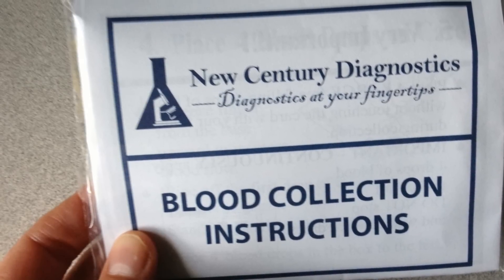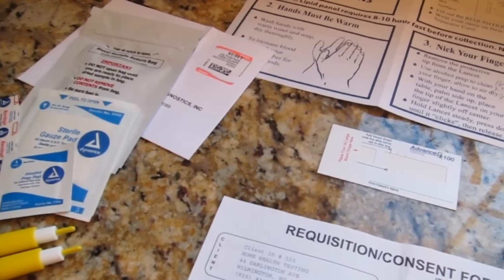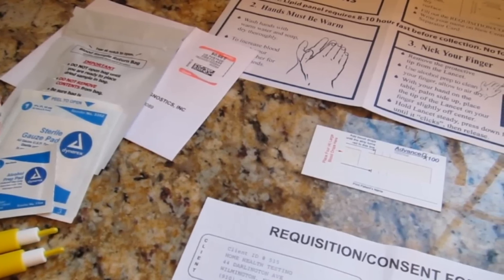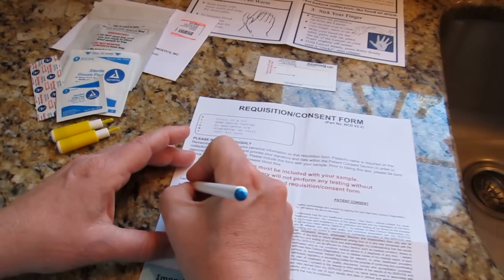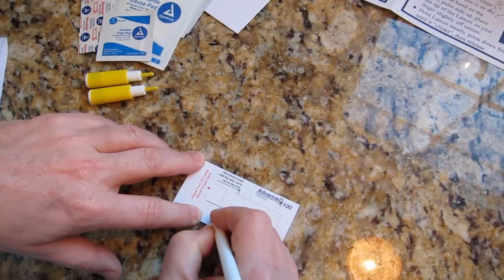In this video we're going to prepare a blood sample to send to the lab for testing. First, open your kit and place it on a clean dry surface. Fill out the requisition and consent form completely and write your name on the Advanced DX test card.